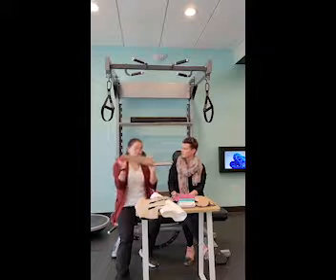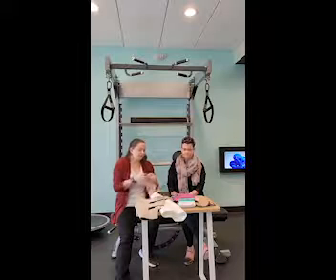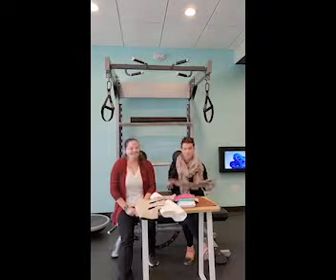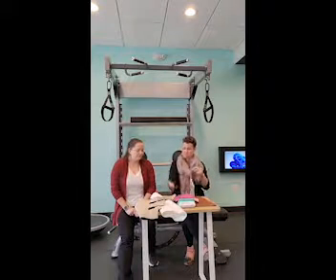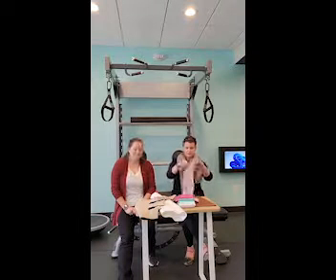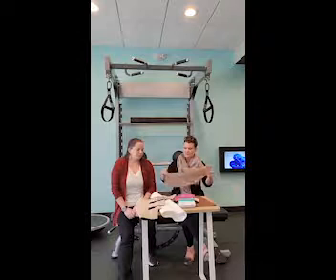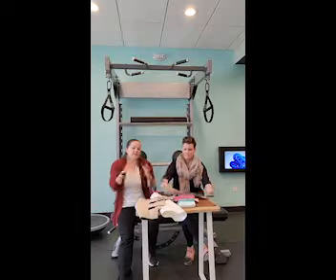If you have a different shape arm than this because of lymphedema, we go into a flat knit. And so we have some examples here. You want to talk a little bit about flat knit? Yeah, so flat knits are custom made for you. They can fit any size, any shape. And Kayla was just talking about the seamless and the circular. These garments do have a seam. So we knit these products custom to your measurements, and then we sew them together. And so this way, if you have more swelling in one spot, or anything like that, this garment will fit you there.